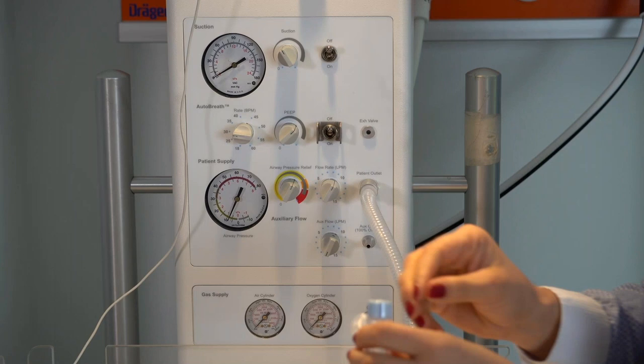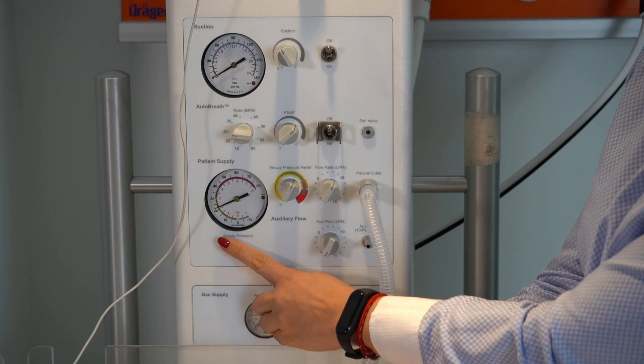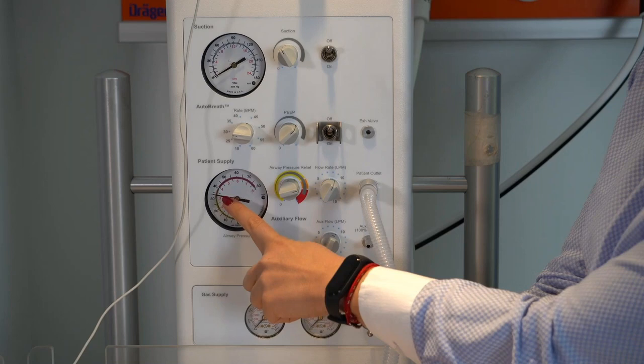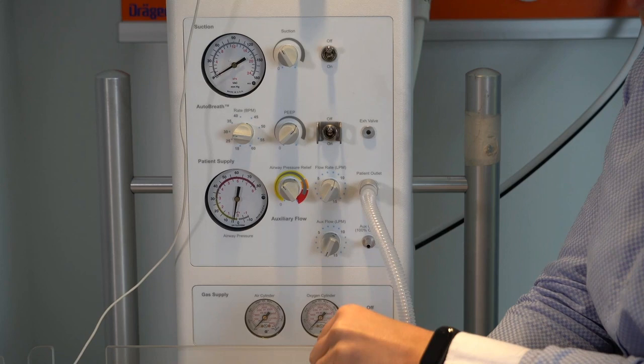So you see, when I perform resuscitation, we can see how much pressure is being delivered to our patient. So if I now increase the pressure, we can immediately see the pressure that we're delivering. And of course, there is a color indication. So there is the red zone, there is an orange zone, and there is a yellow zone. So if I now reduce the pressure, we see just the slightest change in pressure.